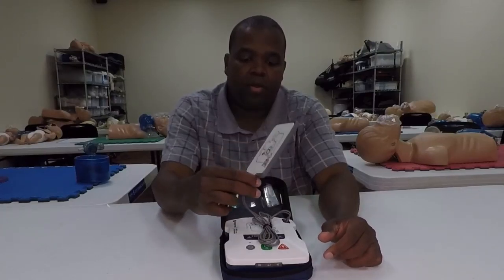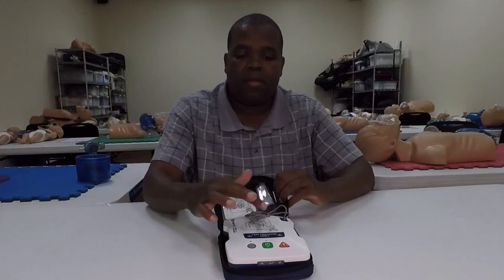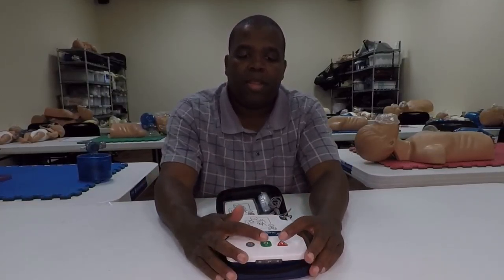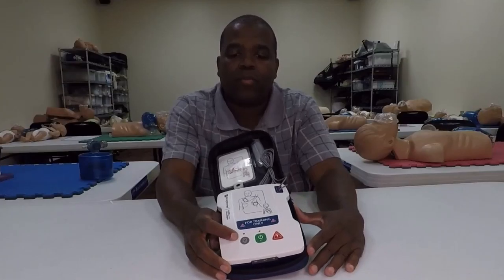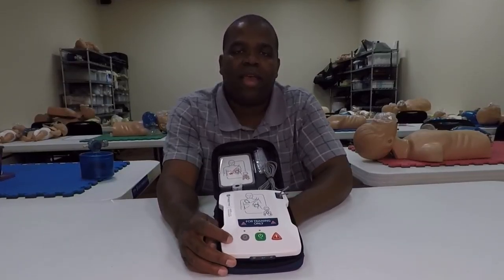We can just stick the pads right on — there's a nice neat little spot for them to be stored. We've got plenty of cable on there. There's a power button here, a shock button here, and there's an extra button right here. Let's go ahead and talk about what that extra button does.